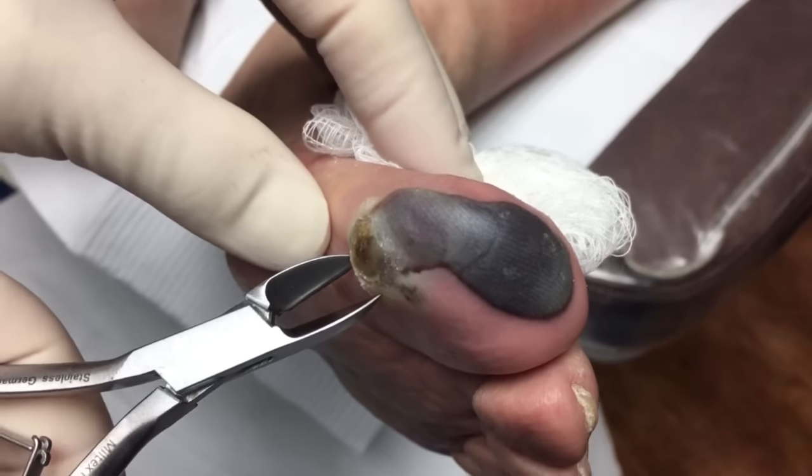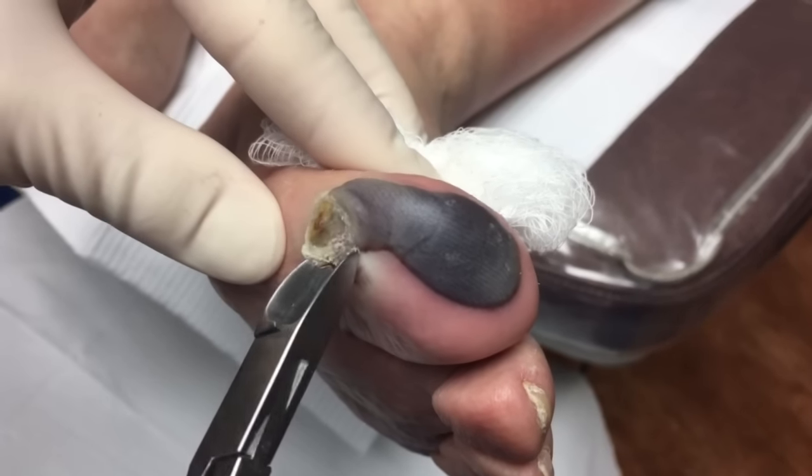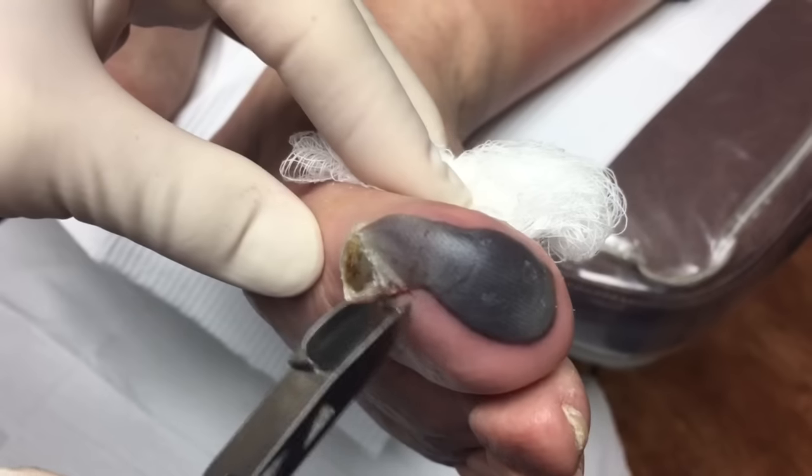This is Dr. Krowitz of Healthy Feet Podiatry. I'm going to open up this blister on this toe. This just started recently. There's probably going to be a little bit of blood under here.